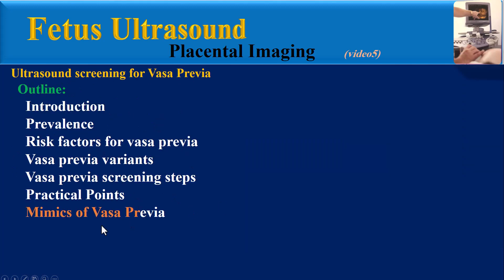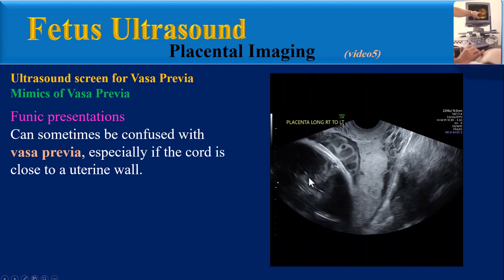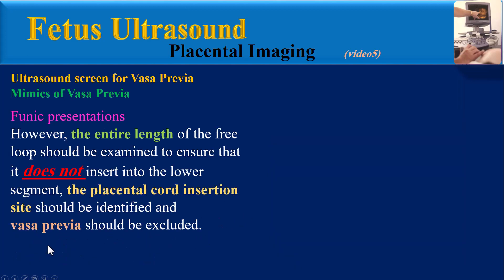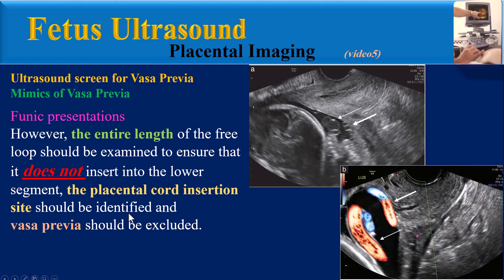Mimics of Vasa Previa: a cord presentation can sometimes be confused with Vasa Previa, especially if the cord is close to the uterine wall. If the patient coughs or if the fetus moves, a free loop of cord will move when the amniotic fluid shifts, allowing the cord presentation to be differentiated from Vasa Previa. However, the entire length of the free loop should be examined to ensure that it doesn't insert into the lower segment, and the placental cord insertion site should be identified to exclude Vasa Previa.